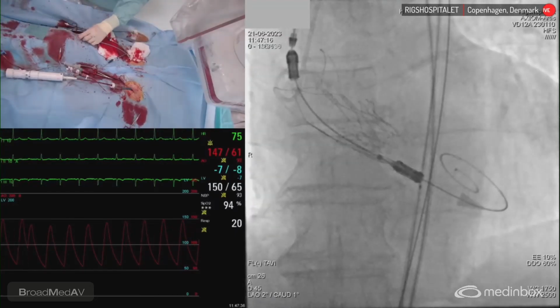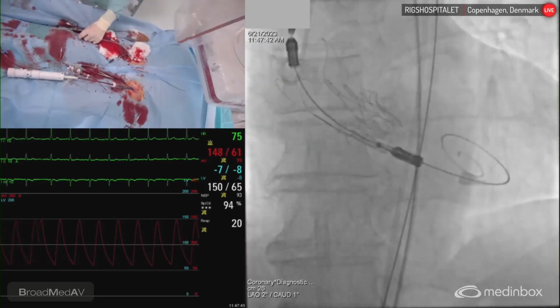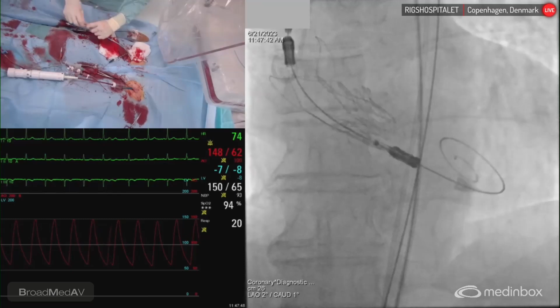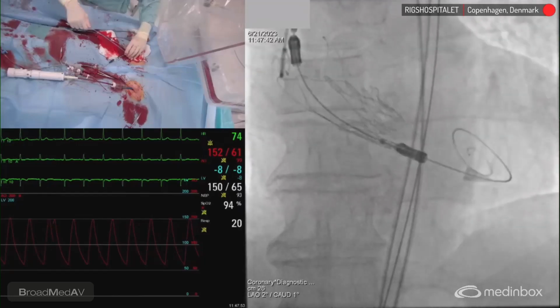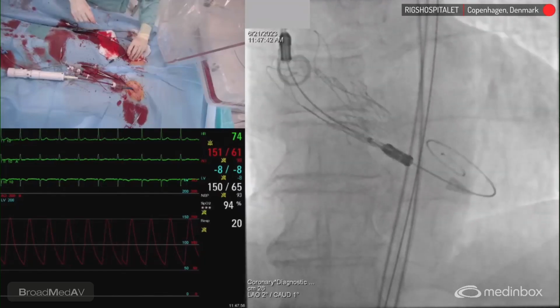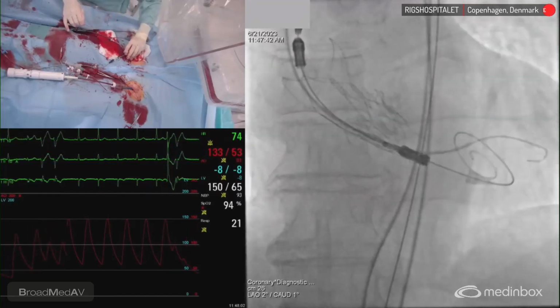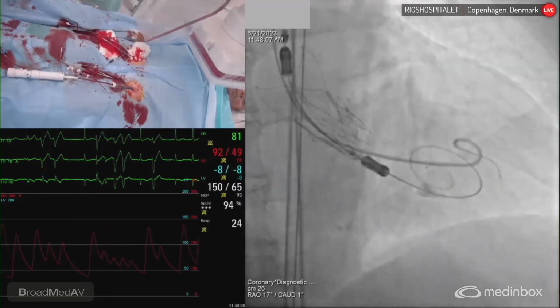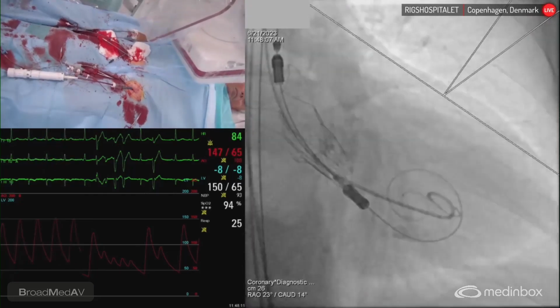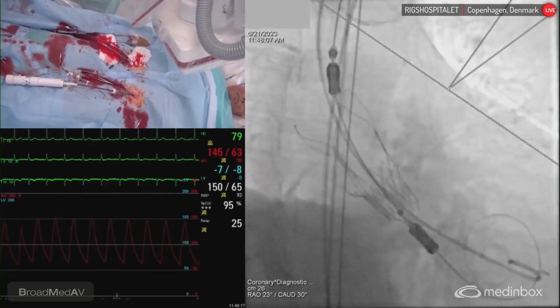Now we cross the valve, but it should be at the inside of the valve. How to do that? Turn it out like this. You have to be in the frame and cross it. But we're not there yet. Now it's the matter of proof of the pudding. We have to overlap both arches. Oh, it's very constrained. So now we have overlap both there.